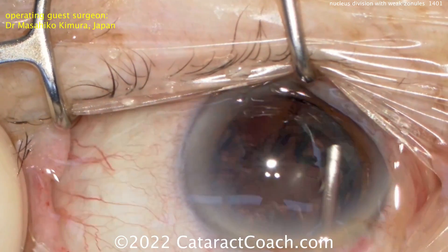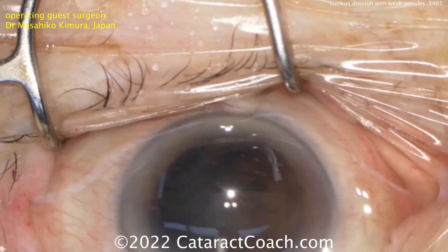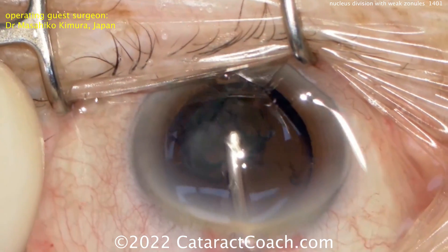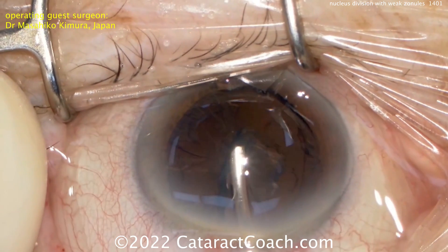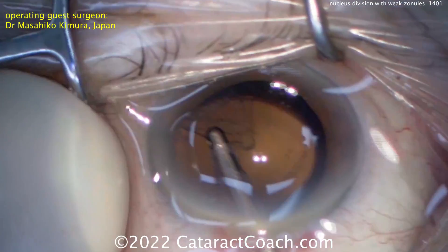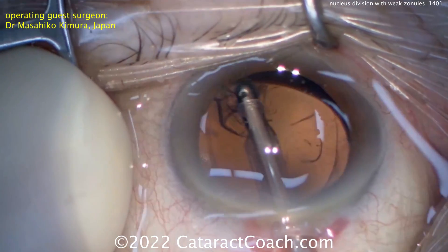At the end, after the nucleus is out, the epinuclear shell can be carefully aspirated. Then the I/A probe can be used to remove the cortex. And at the end here, we'll put the lens in the bag. It looks pretty reasonable — good support. The patient probably got a capsular tension ring, though that wasn't shown in the video.